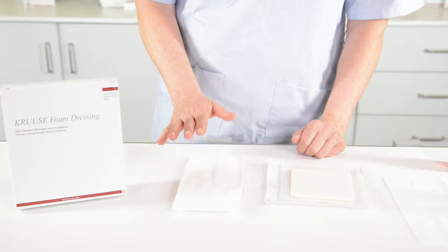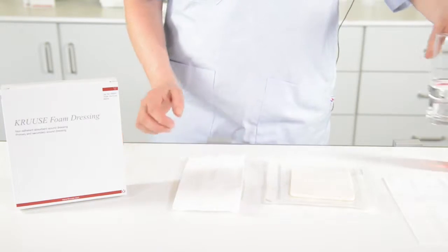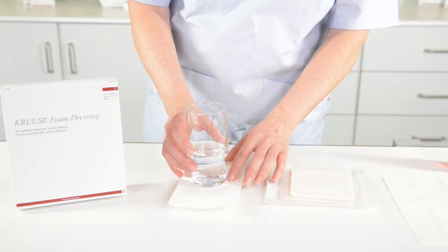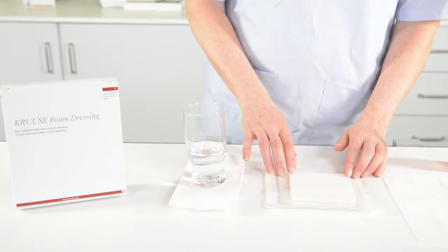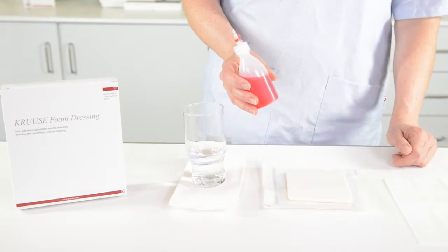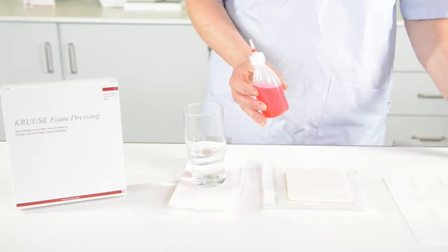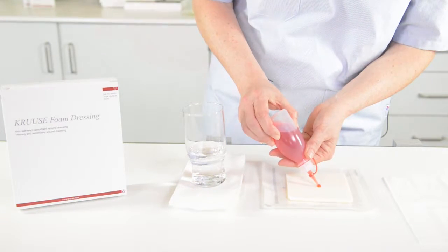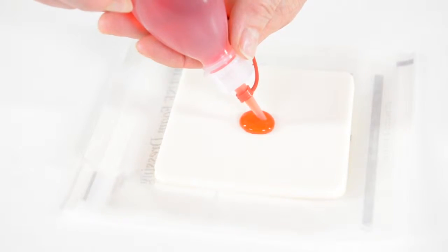To simplify how the water will get into the foam and expand through the backing, with a bandage on top of that I will put on a bit of compression. If we are in a situation where we don't have the dish and only have the foam, I can do the same. This is just some artificial exudate, but you can use water or whatever liquid you have. You pour it gently onto the foam and it starts to enter the foam.